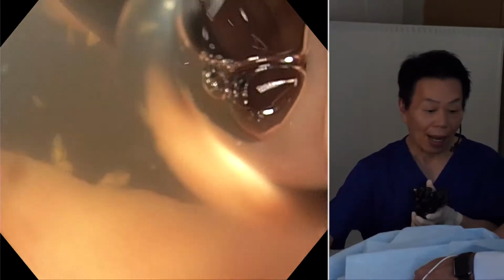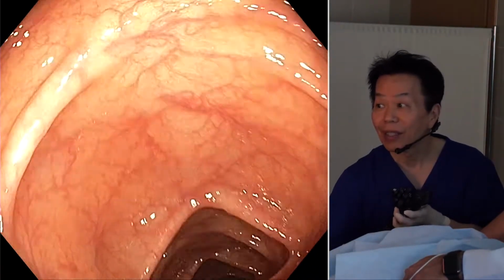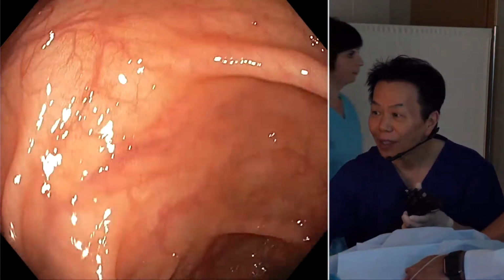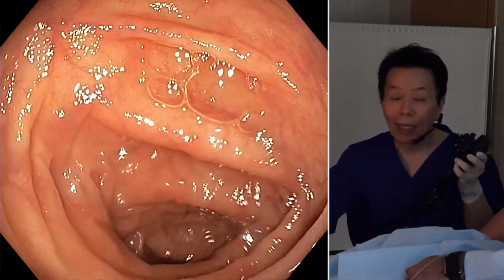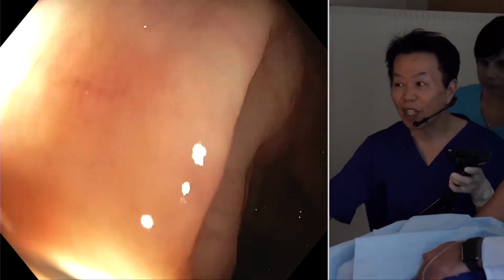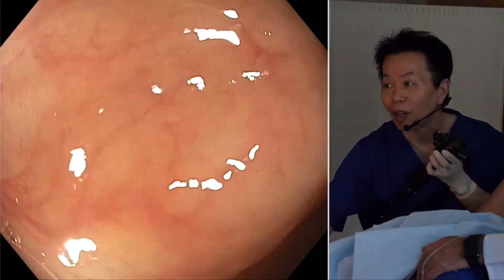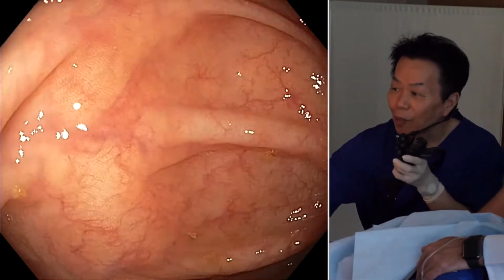And can you see the patient is rather obese? When the patient is obese, you can use this technique. Now, can you see it's very easy to go forward in the right decubitus position. And sometimes I even use the prone position for very obese patients. Lie on the belly. So maybe from the beginning, I ask the patient to lie on his or her belly, and it will be easier for the intubation.